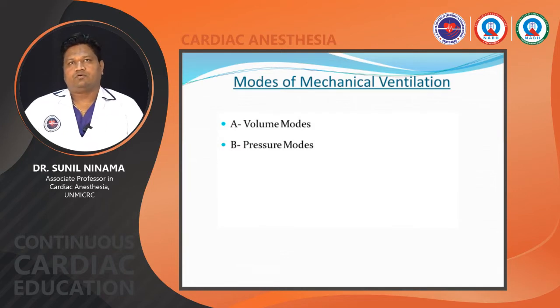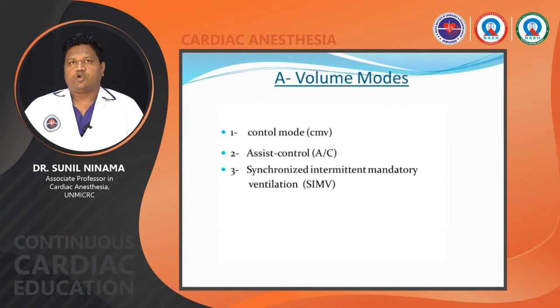Modes of ventilators. There are two modes, the volume modes and the pressure modes. Volume modes may be control mode, assist control mode, or SIMV, synchronized intermittent mandatory ventilation. We are going into the details of these volume modes.